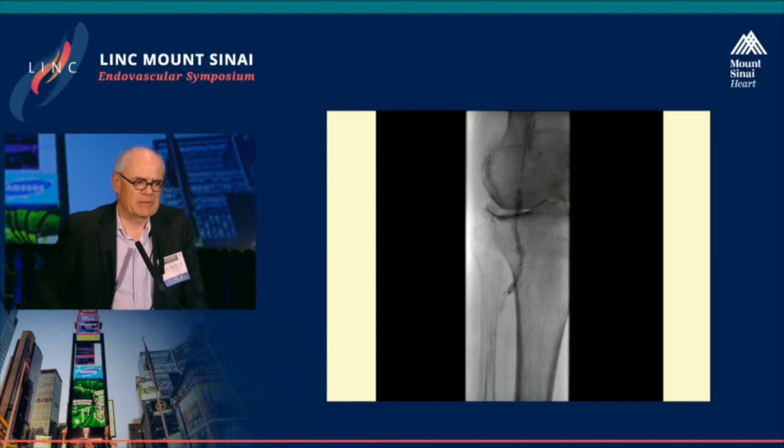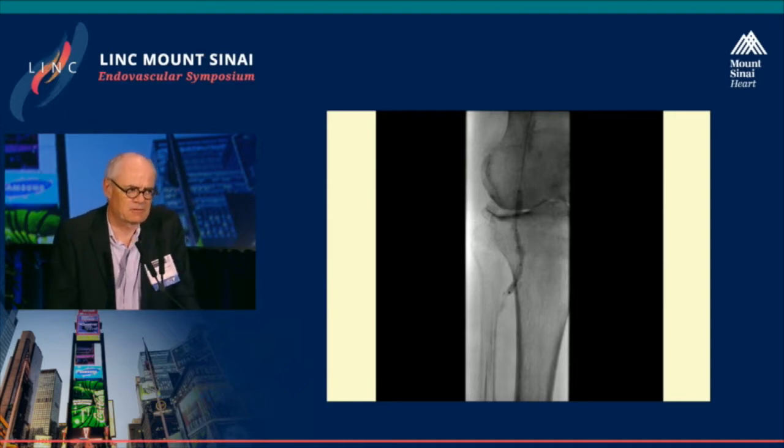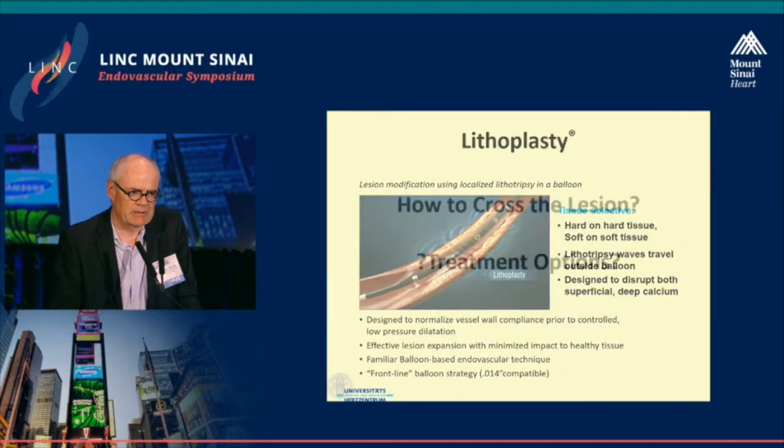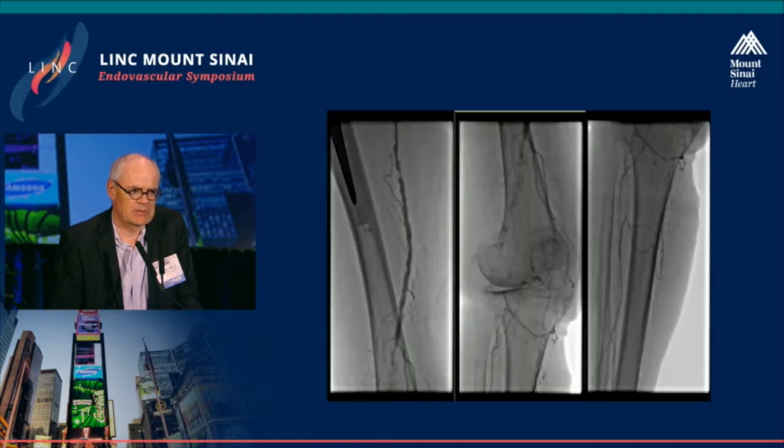So basically what happened, and this is what I'm not going to show, is I was using simply a 4 French catheter and a .035 glide wire, and it was possible to get across the lesion in the true lumen. Probably it's worth going back and explaining why it was possible to get across this lesion in the true lumen. The main important step to stay true lumen is to get access into the occlusion in the true lumen.